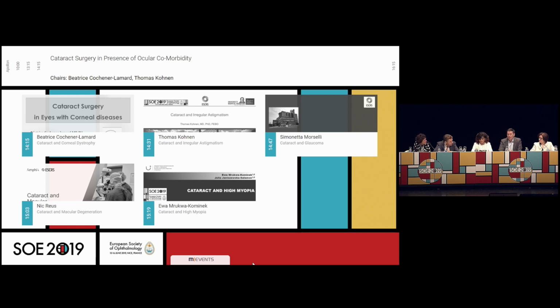The reason I use yellow lenses most is for artists who like to paint. Because when they have the cataract removed, the world looks a bit bluish or purplish, and they hate that when they are very critical about colors. In these patients, I always put a yellow lens in. That's actually my most prominent reason for implanting a yellow lens.